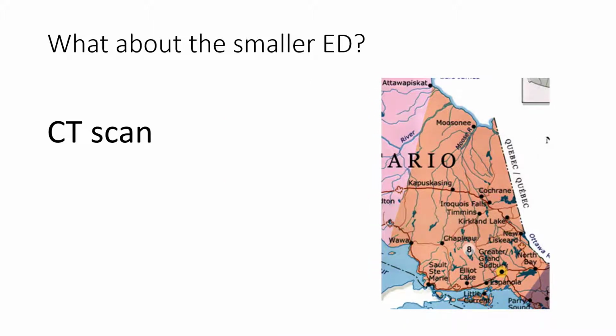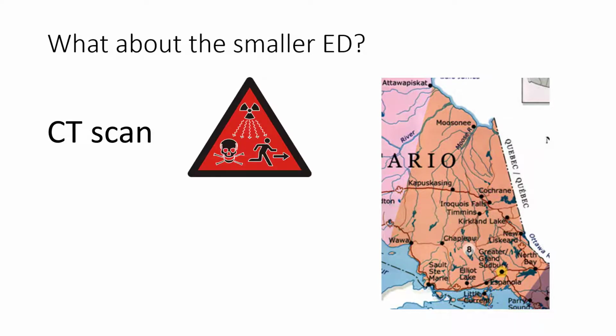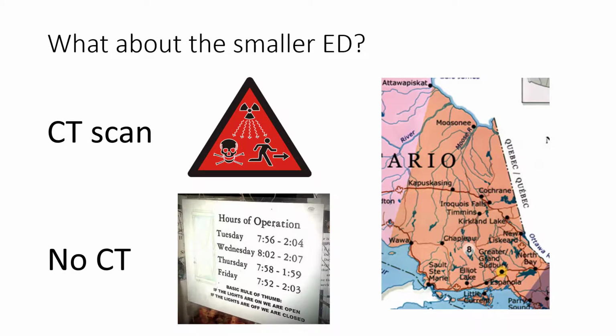It is the best test for renal colic, but just because you can now easily get a CAT scan does not mean you should use it all the time for renal colic patients. Of course, the main reason to still avoid its use is the neoplastic risk of radiation. This is especially the case in younger patients. In the smaller hospitals without a CT, POCUS makes life so much easier, especially in off hours when labs and imaging are closed and only available on a call-in basis.